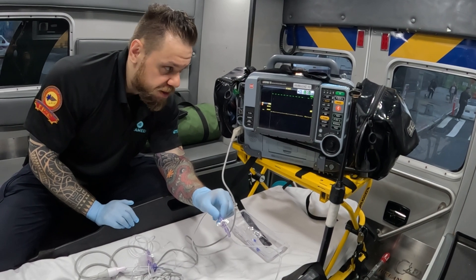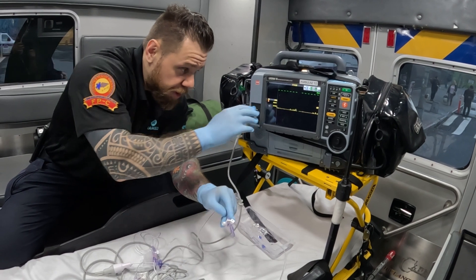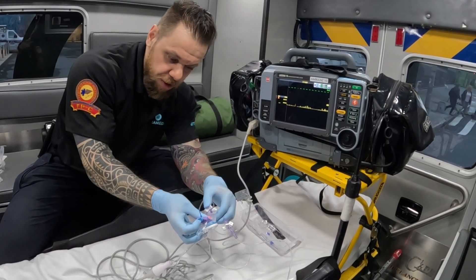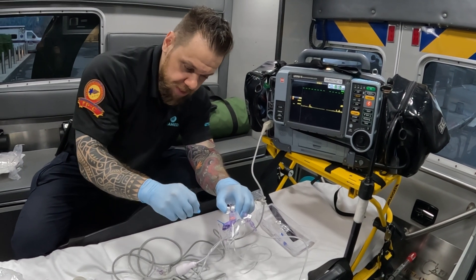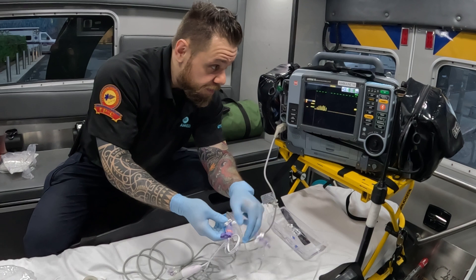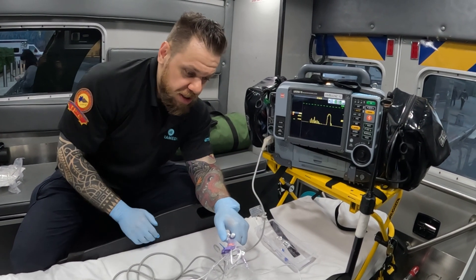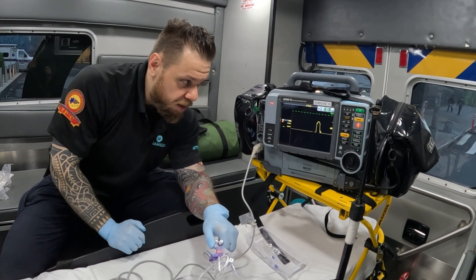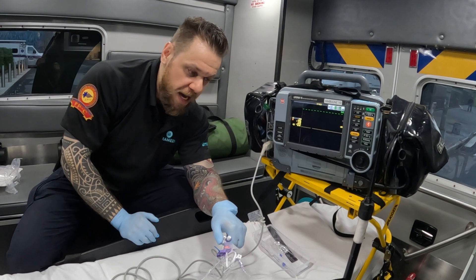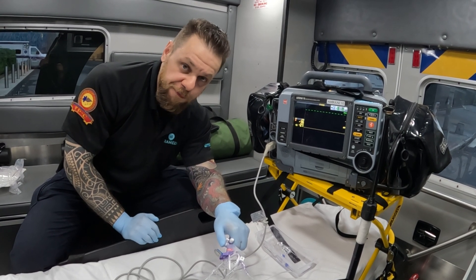You want to do a fast flush test. What is a fast flush test? As your blood pressure is appearing, you're going to find the pigtail connected to the patient and quickly pull on it so it flushes the system. Basically, you're delivering quick normal saline to the patient and then looking at the oscillations — what happens once the waveform returns.